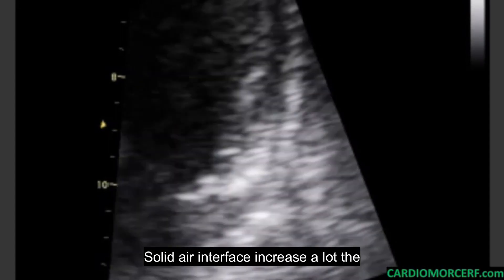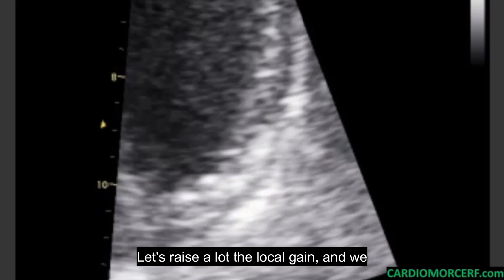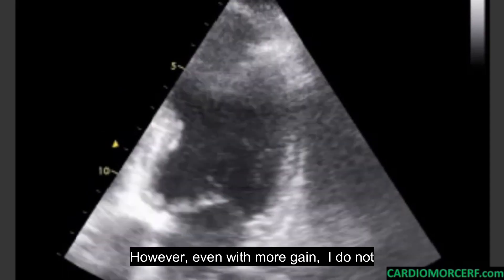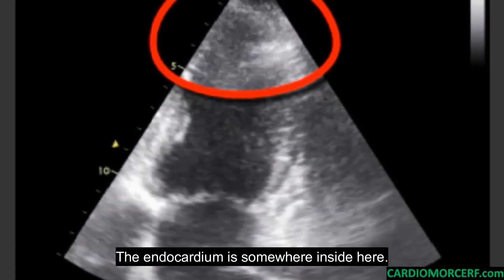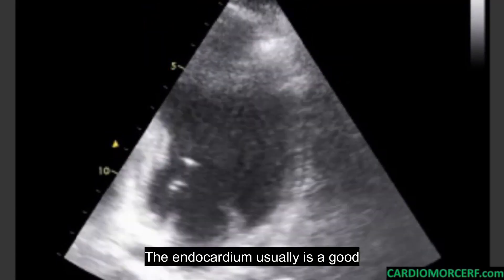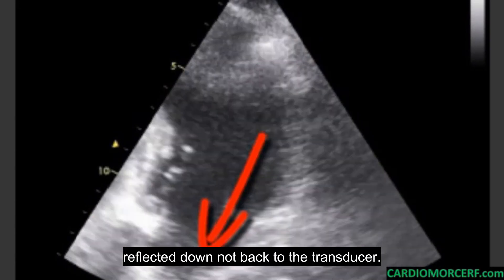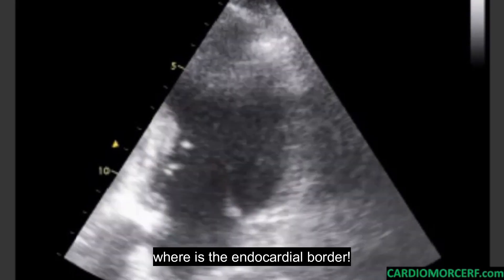Solid-air interface increases a lot the lateral size of any structure. Let's raise the local gain a lot — and we now see the endocardial border. However, even with more gain, I do not visualize the walls correctly. Look at the apex — the endocardium is somewhere inside here, but I do not know where. The endocardium usually is a good reflector and thus functions as a mirror. The ultrasound that hits here will be reflected downward, not back to the transducer. We are not sure in most adult patients where the endocardial border is.